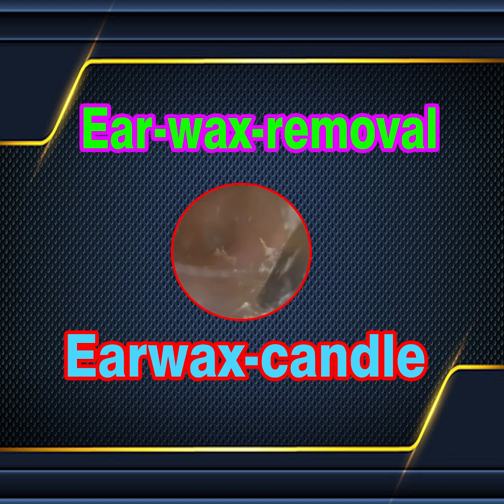So again, just going to see if the Curette helps here. I'm trying to just very thin layer. I think I've got underneath it now. And you've got to be controlled. You've seen there that I applied a lot of pressure upwards and the Curette came over the top of the skin. You don't want to let that Curette then flail around in the ear canal, so you've got to have full control, just like that.